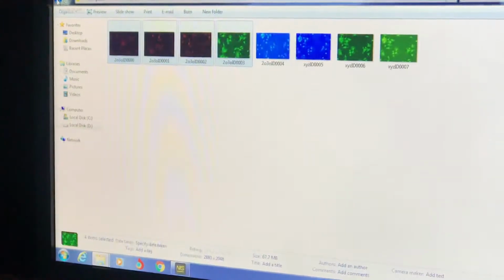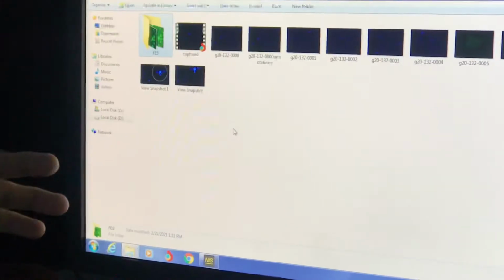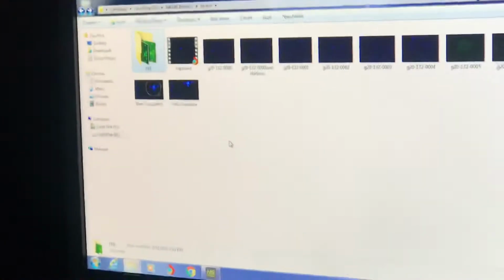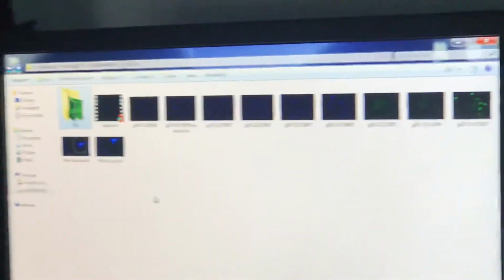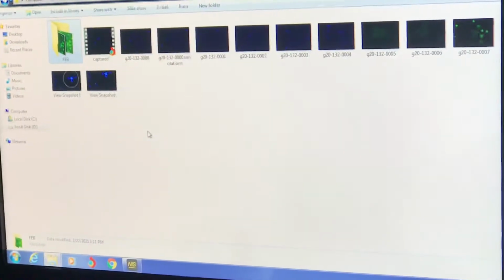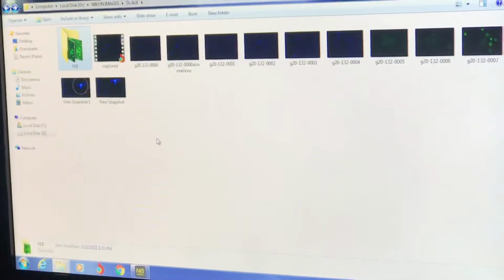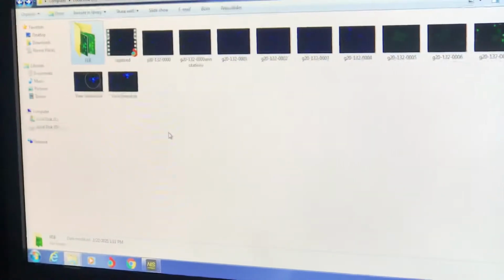Similarly, when the month of March starts, you say, now I want to bring all the patients in March. Or any method, whichever you decide in your lab among your users, you can have that method, but this is how we will use the automatic capture method. So it's easy for you to tomorrow come and check that the pictures belonging to the slide for one patient are these. So you don't have to do file save as, file save as. Any doubts?